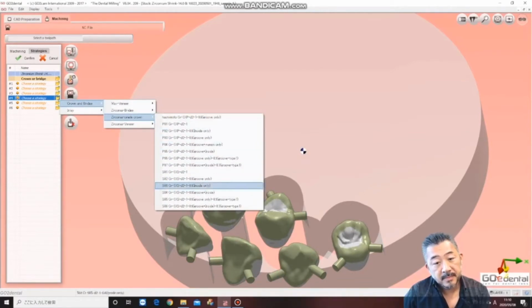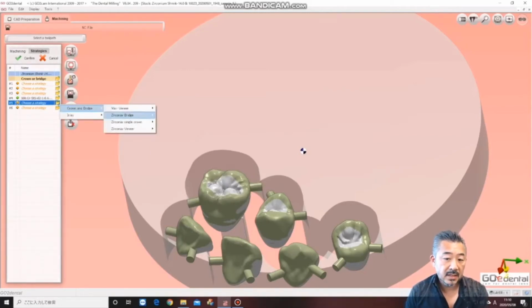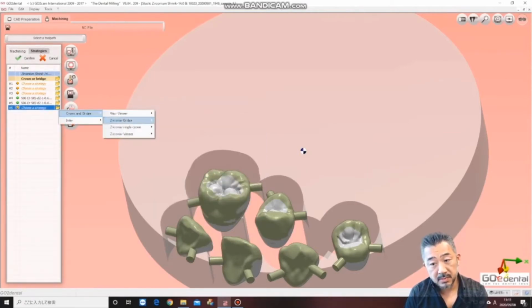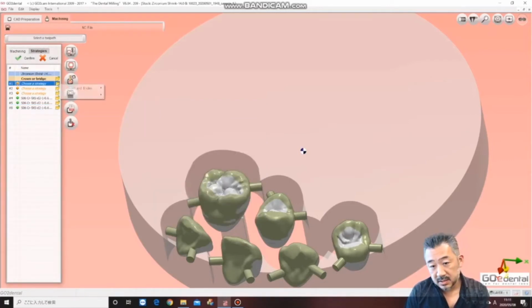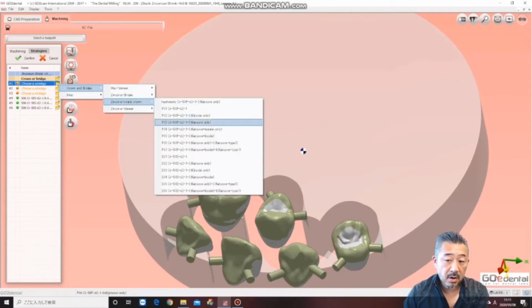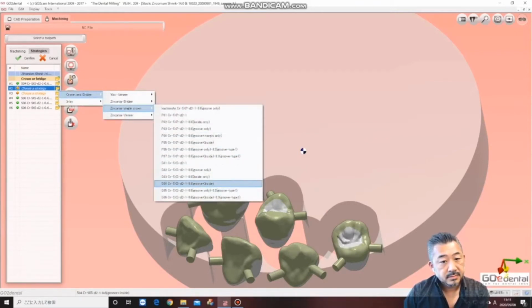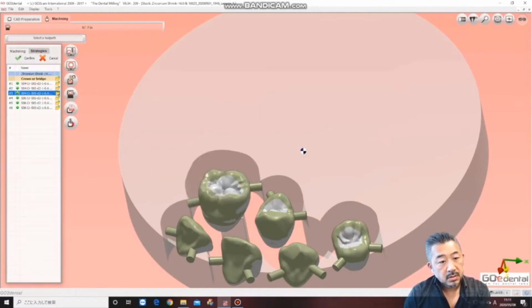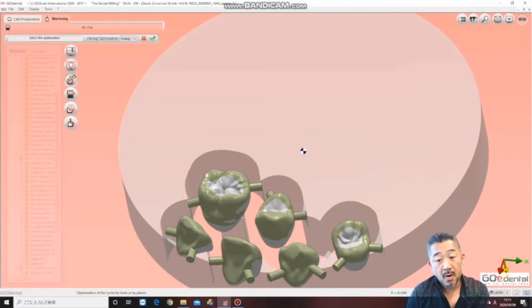This time, from the 5-axis machining pass, I'll make a machining pass that cuts the outer side up to 2mm and 1mm, the inner side up to 0.6, and the molar occlusal surface up to 0.3. Within that range, I'll decide the machining pass for all crowns one by one.